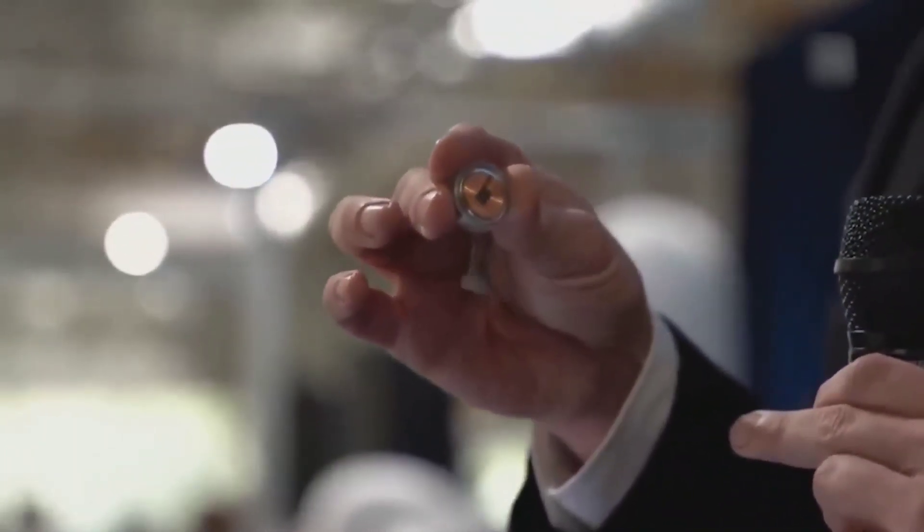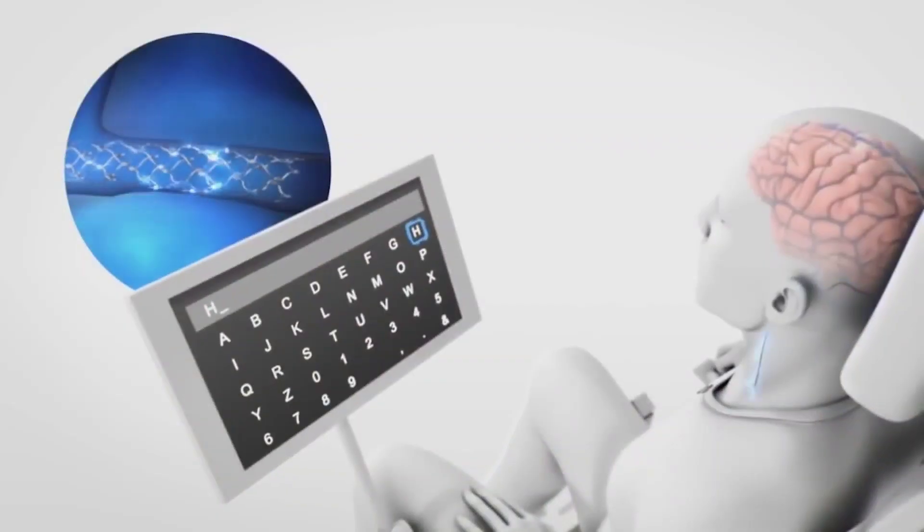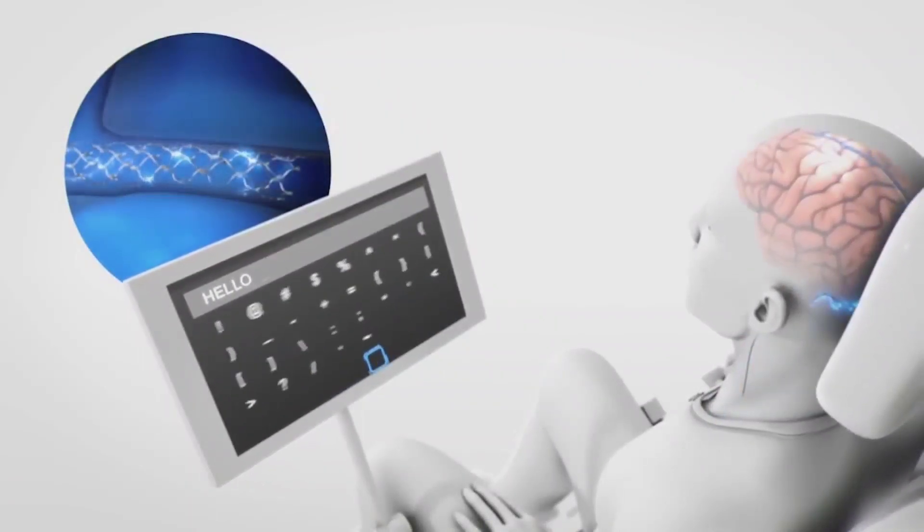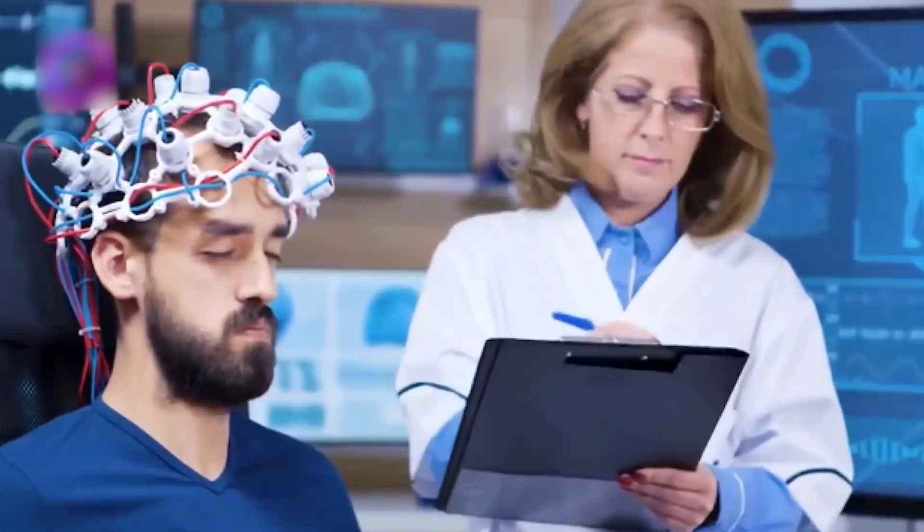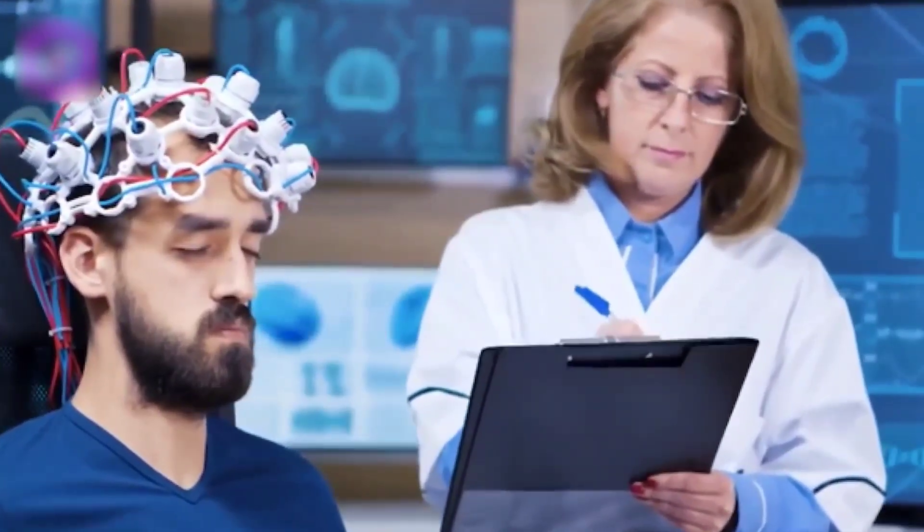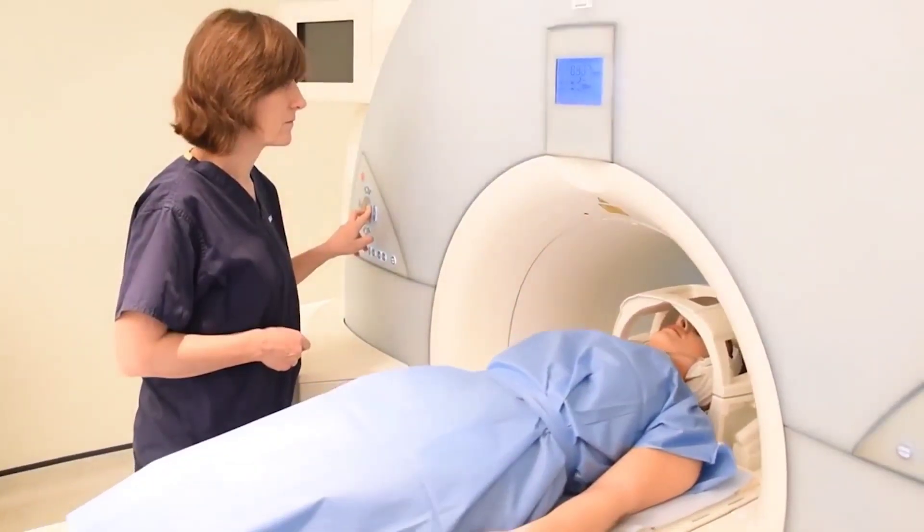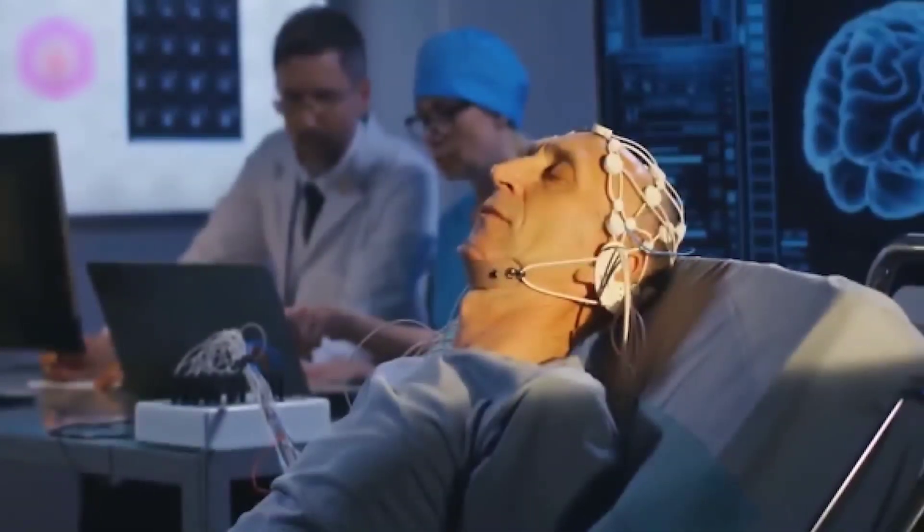So Elon Musk announced his most sci-fi project to date this week. A computer chip attached to extremely thin wires and electrodes, all of which are intended to be implanted in a person's brain by a surgical robot. The implant would communicate with a computer via a wireless connection to a small behind the ear receiver.